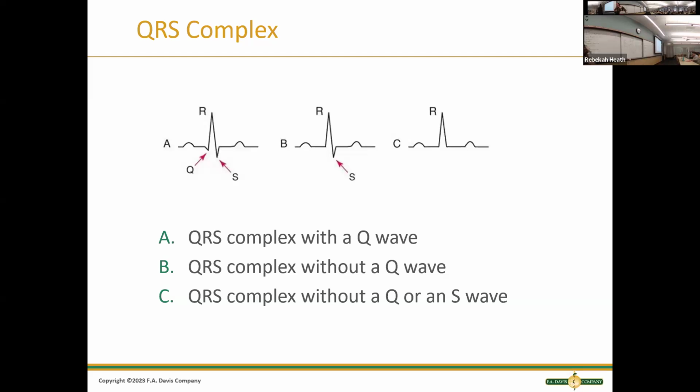So with the QRS, this gives you a little bit of an example of how QRS waves look a little bit different, right? Sometimes you might be able to see the Q as it deflects, the R as it goes up, and then the S as it deflects again. That's really beautiful. I can see all of those bundled together. Sometimes you can't see anything but the R. Either way, we are always going to call this a QRS complex because the Q and S are just kind of hidden in there.